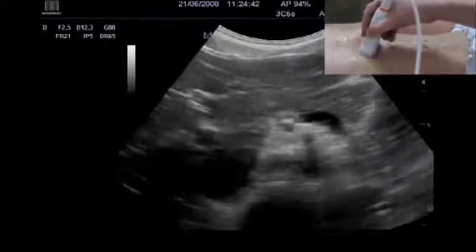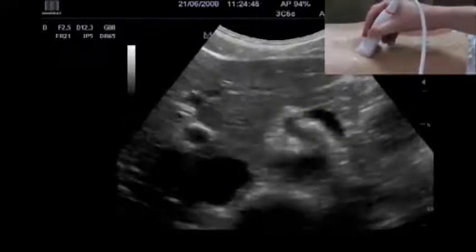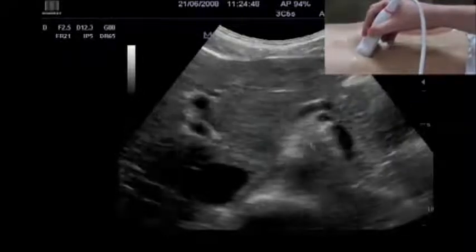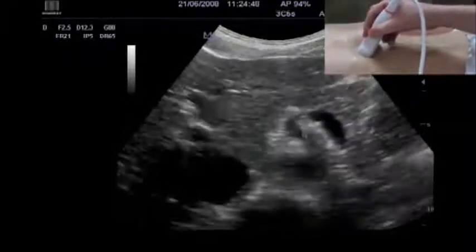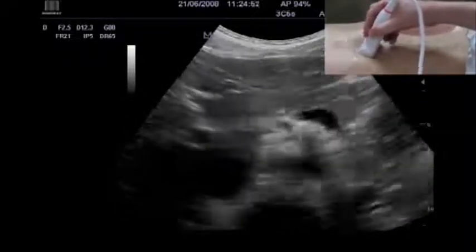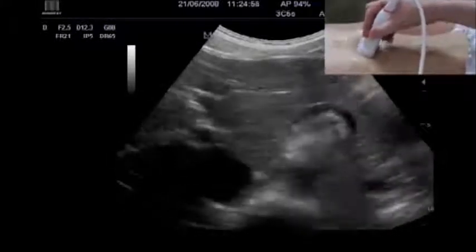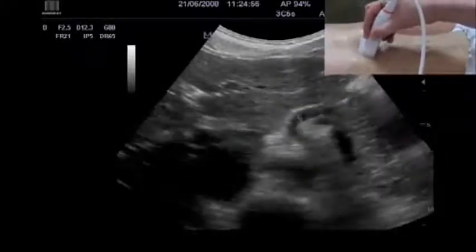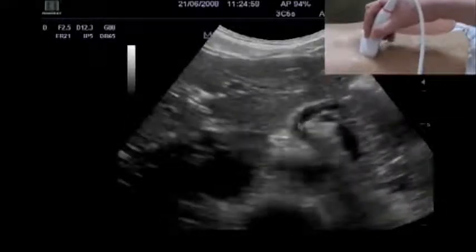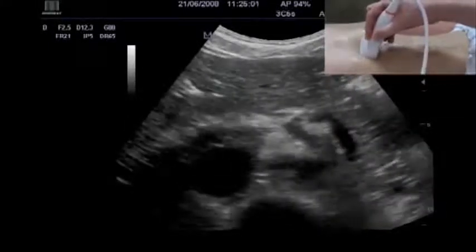What else can we see? We can see the different vessels that arise from the aorta. Here first is the celiac trunk, which gives rise to the splenic artery and the hepatic artery.